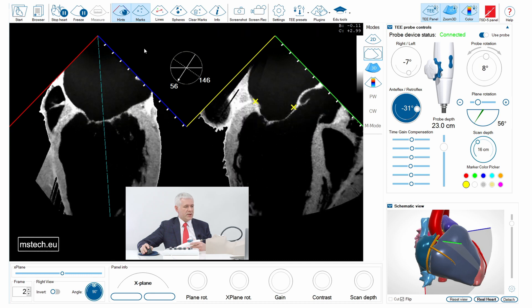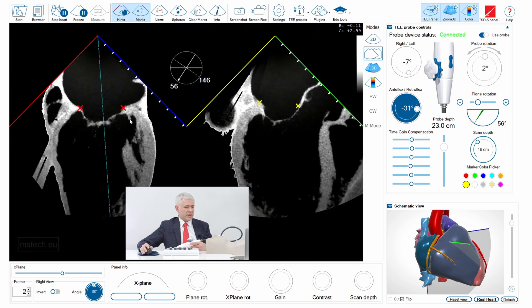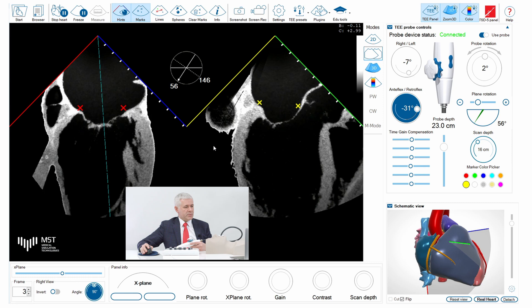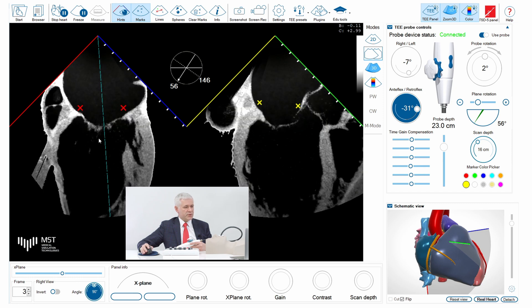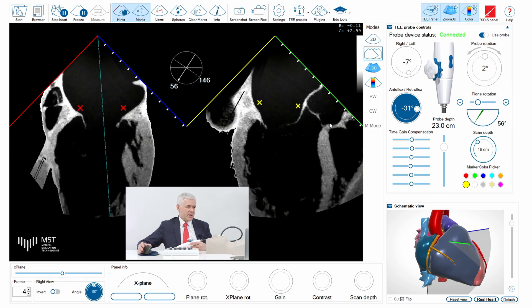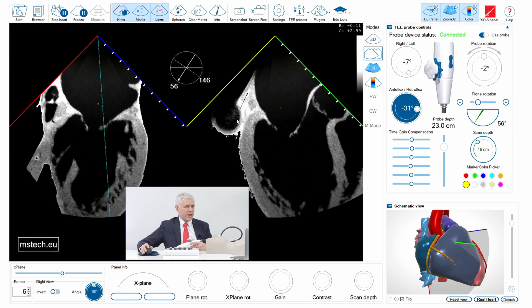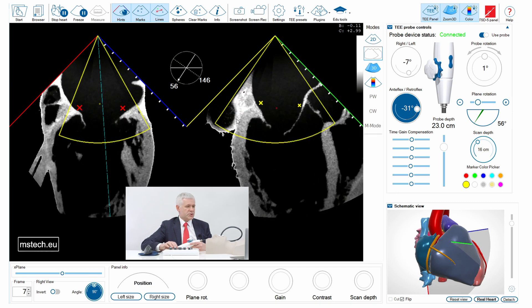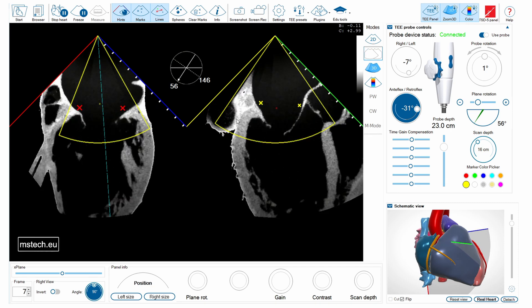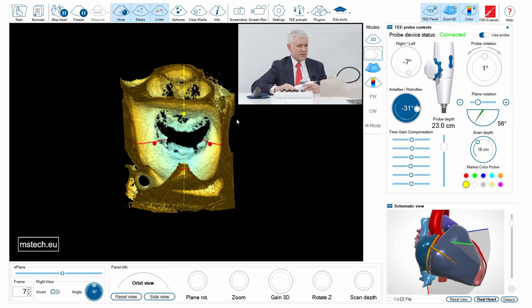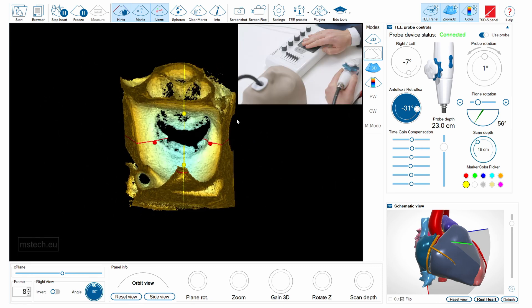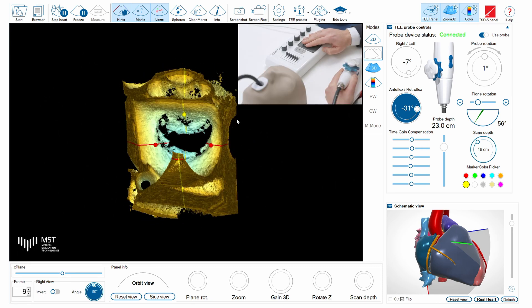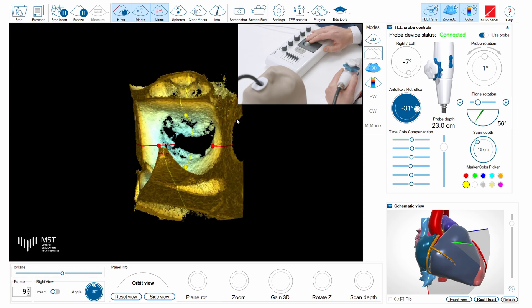Here I marked with red and yellow colors the planes of the intercommissural view and the long axis view. I can also connect those markers with lines — the red line and the yellow one — and then switch to 3D view, which is available here with the lines superimposed on the mitral leaflets.